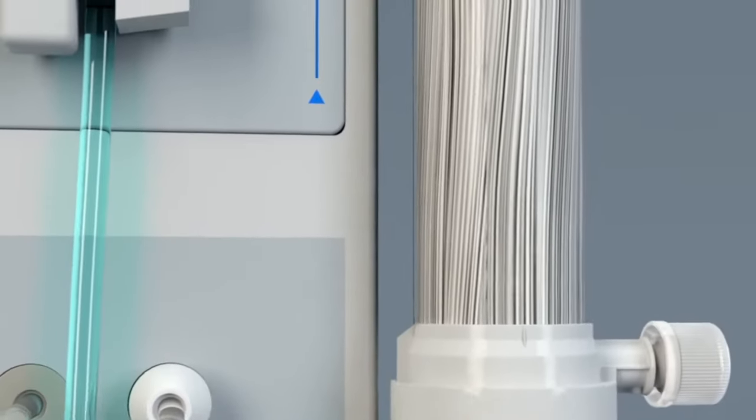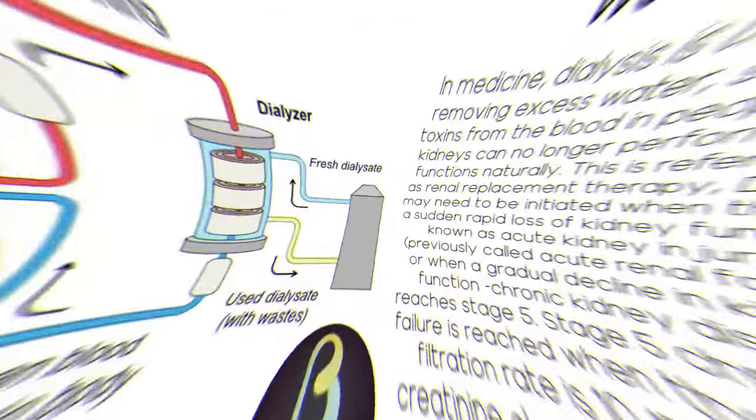How the dialysis machine works. The dialysis machine draws up and warms purified water to physiological temperatures. The heated water then undergoes deaeration under vacuum to prevent dissolved air from coming out of solution as negative pressure is applied during dialysis.